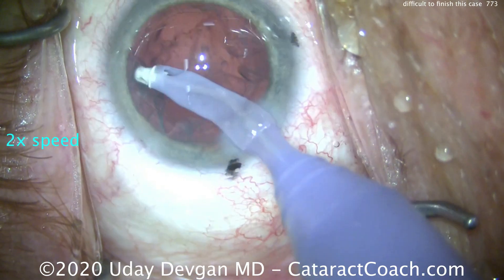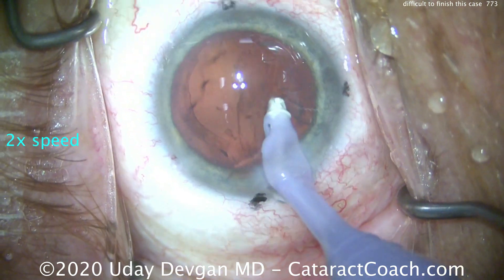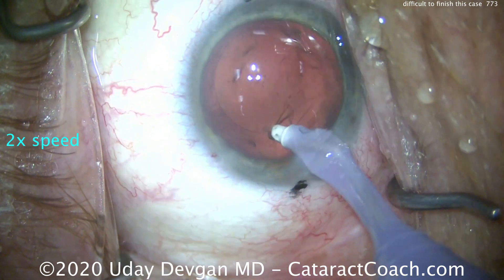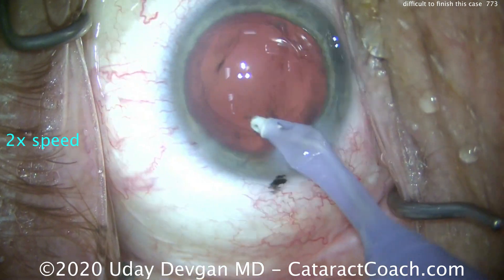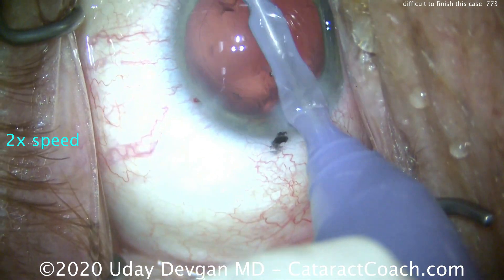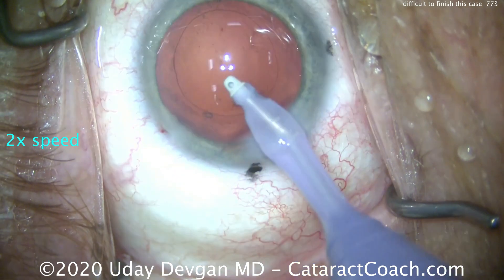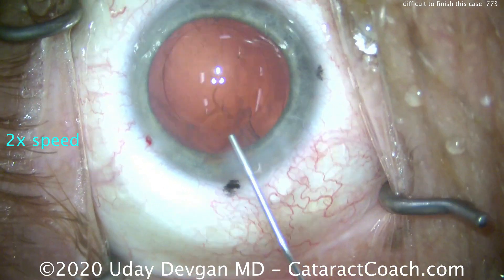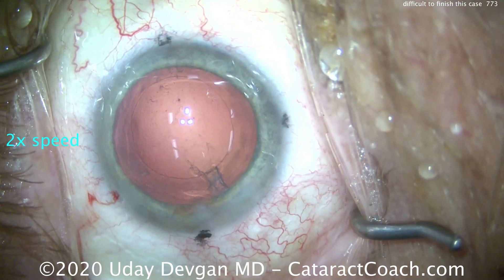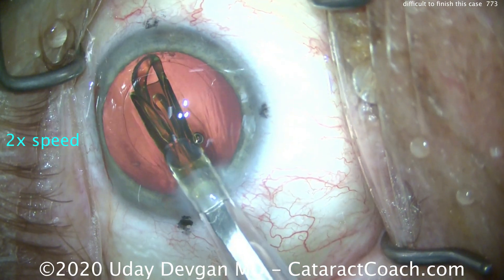Nice and easy on the cortex removal — but what do I notice? As we remove the cortex, the anterior chamber seems shallow. The posterior capsule keeps coming forwards, so it's really difficult to access everything. The capsule bag has collapsed. Why? We have a lot of infusion pressure, but some of the fluid is going through the area of zonular breakage and into the anterior hyaloid face. So fluid is now collecting in the anterior hyaloid face, and that little bit of sub-incisional cortex is tough to get out because when we put the phaco IA probe down that area, we end up getting just more infusion going into the anterior hyaloid face.